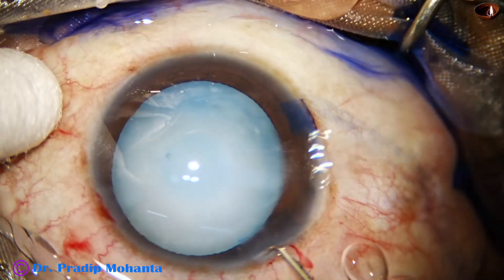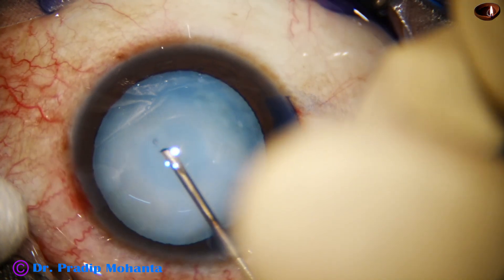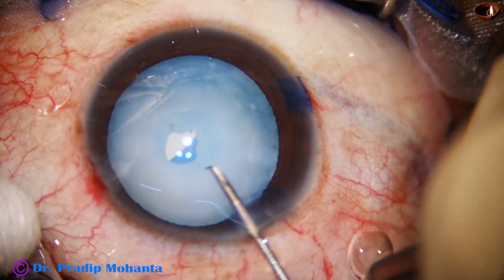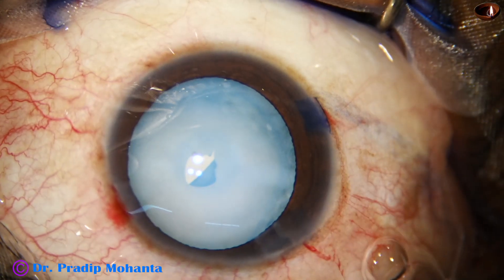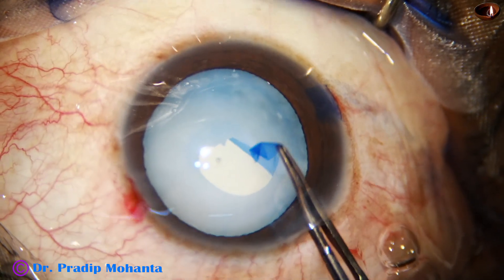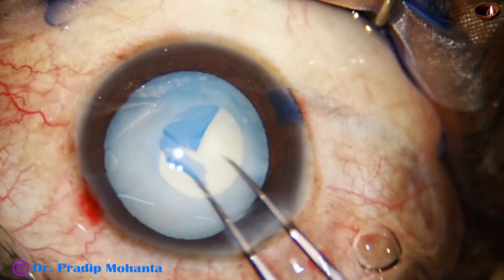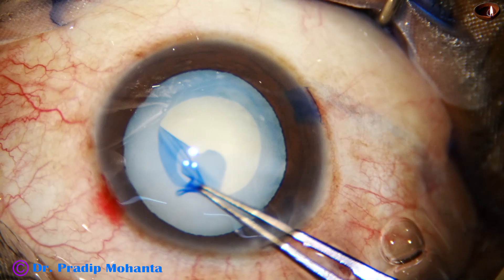Now let us see how to do the rhexis in such cases. I am using a cystitome to make a puncture at the center of the capsule, and I find that there is no egress of any oily or milky fluid. I hold this capsular tag and go to the periphery, and find that there is no tendency of the capsule to run away.